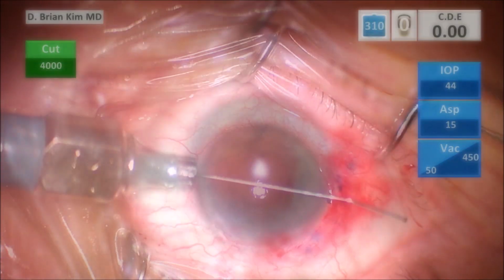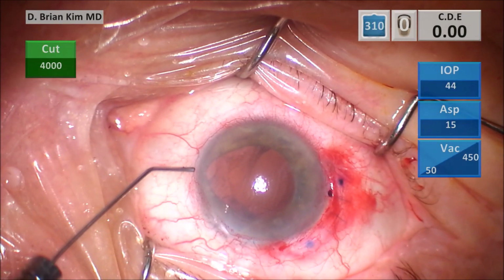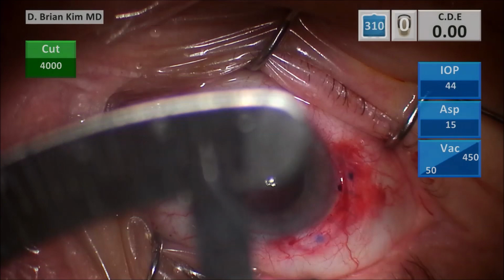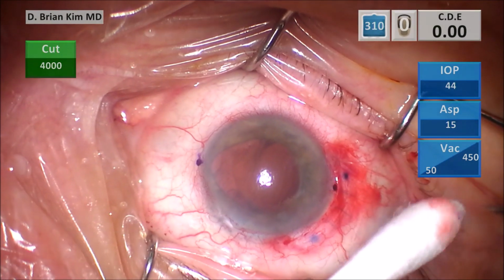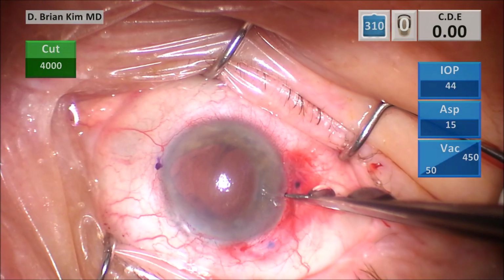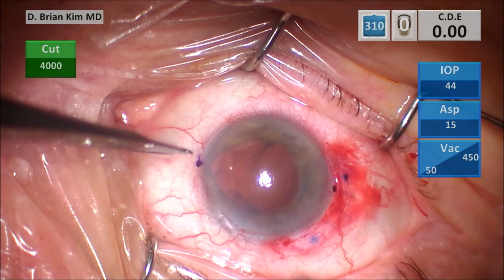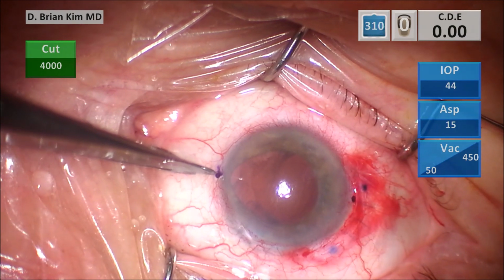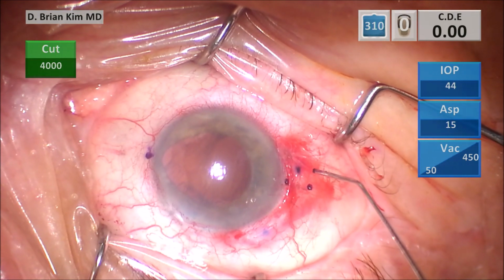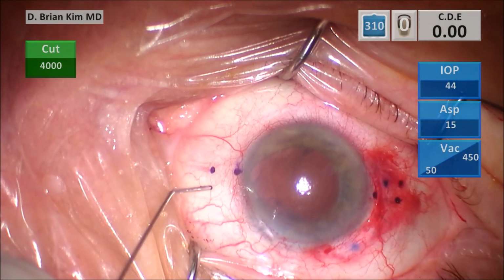I make my limbal mark, marking 180 degrees away. I'm using the tip of this cannula, which really creates really nice round and small marks. I'm going 2.5 millimeters posterior to the limbus, making sure the surface is dry, making sure I'm radial with the mark, indenting the sclera, and then placing my ink mark right over that mark on either side. So again, marking on the right, and then marking 2 millimeters adjacent on the right side and then the left side, and making sure that those marks are radial.